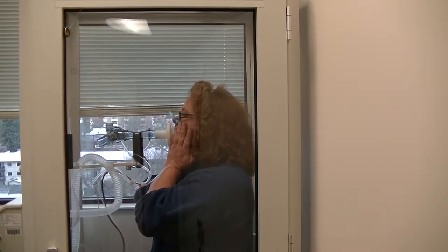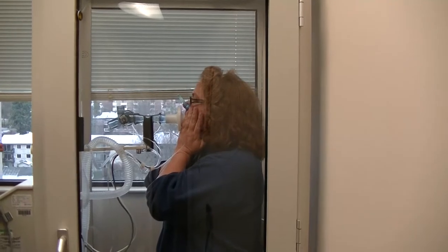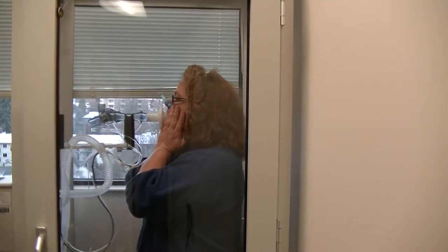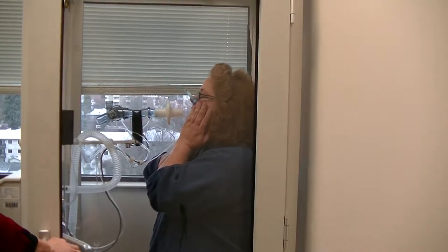This is where I'm going to ask you to put your hands up to your cheeks, hold your cheeks in. We're not going to pant yet. But when I tell you to pant, I want you to follow my hand and use little tiny in and out. And pant for me — in and out, in and out, little tiny. Perfect. Keep going, keep going, in and out, in and out, in and out. Perfect. Very nicely done.